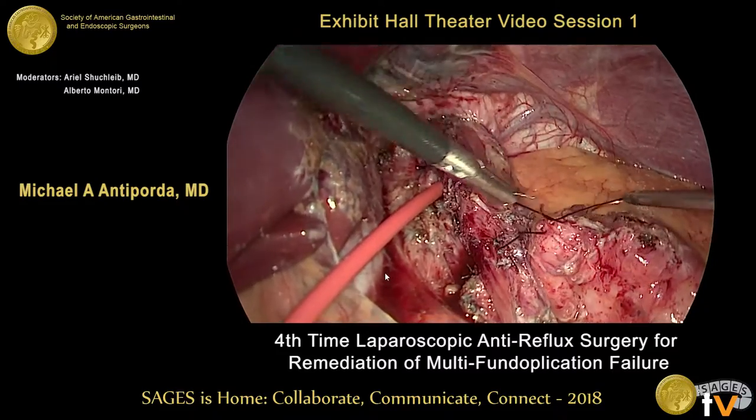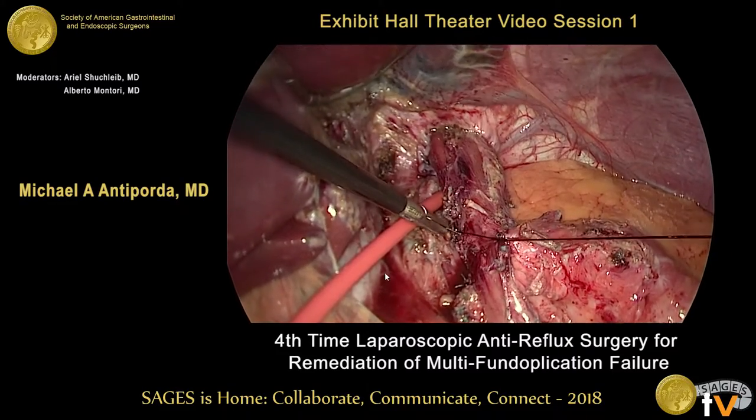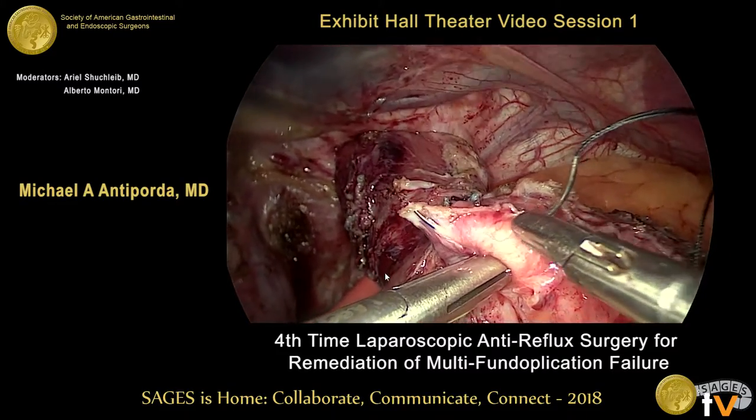Care is taken to ensure that the anterior vagus nerve is preserved.